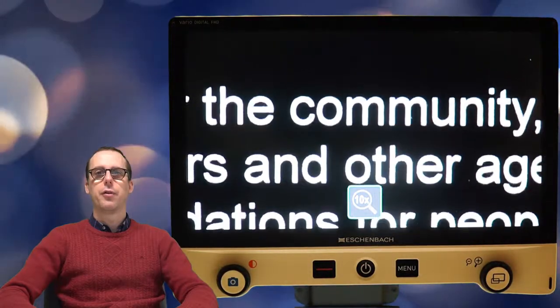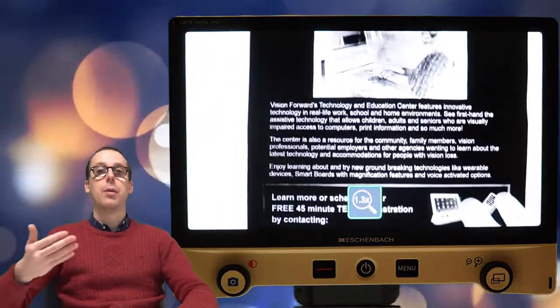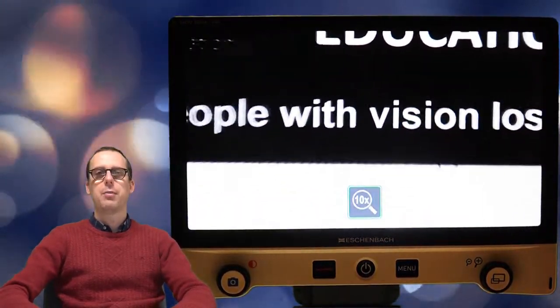Now, let's think about some of these advanced functions and talk about those. So we do have a find feature which we can use, and inside the magnification dial is actually a button in the middle. If you press that, you're going to go into the find mode. So say that you're magnified at 10 times and you want to zoom out to get an overview of the page that you're looking at, find an area, then zoom back in again. That's what you're going to do with your find mode.